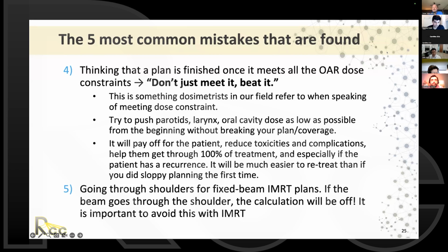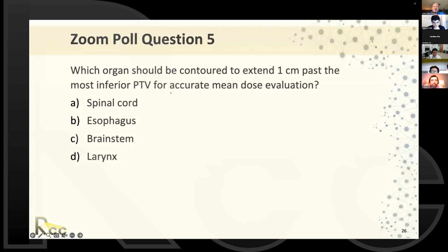Excellent. Thank you, Dr. Malik and Dr. Safavi. See, we can always make it more perfect, the CB CHOP method. So this is amazing feedback and a concept that you have added. Very good. So we can go to question number 5.